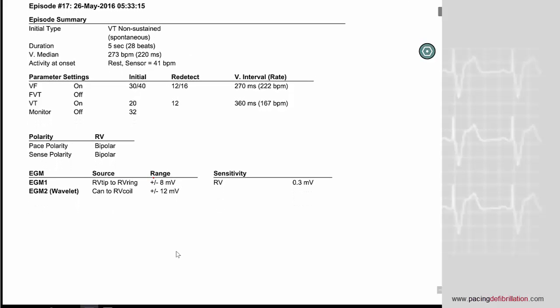If you look carefully at the text, it's going to be labeled 'VT non-sustained with spontaneous termination,' and the total episode will last five seconds. You can see that the patient was programmed with an initial count for VF as 30 out of 40.